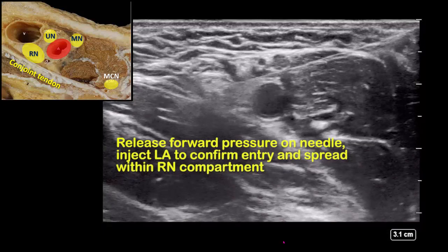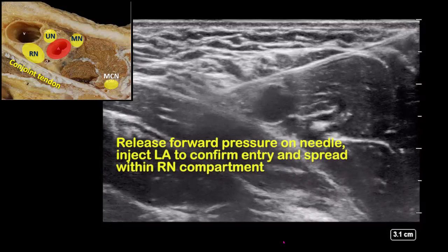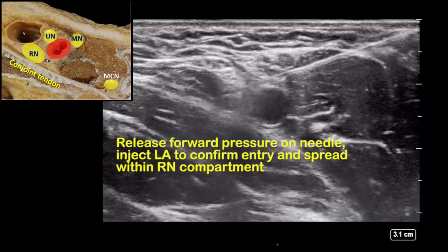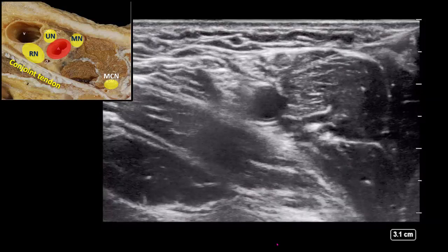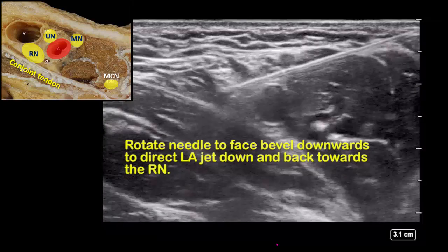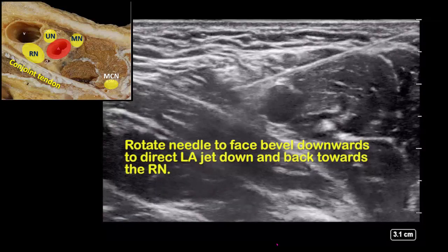Perform a test injection and observe spread within the radial nerve compartment. One trick I recommend is to rotate the needle bevel to face downwards and backwards, as this will promote spread towards the nerve rather than away from it.